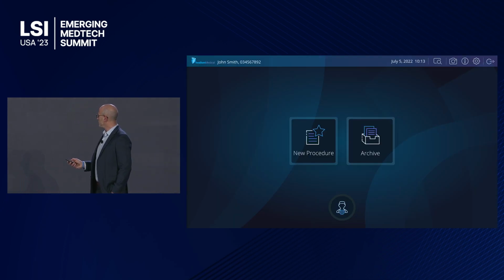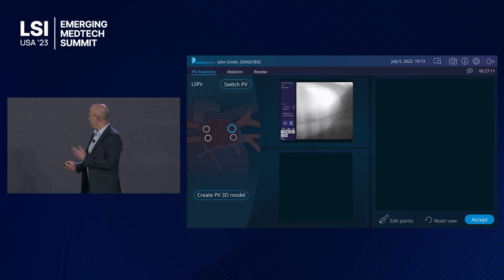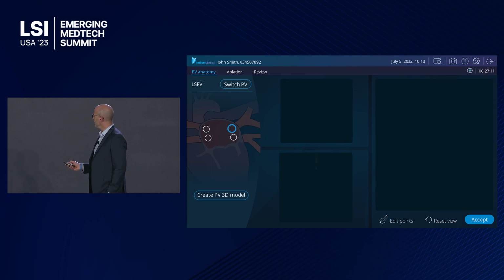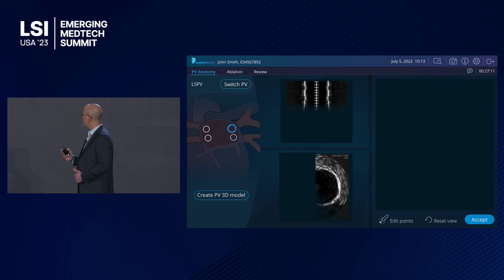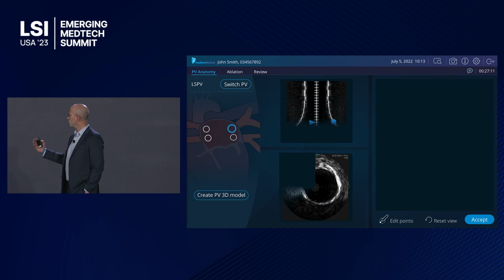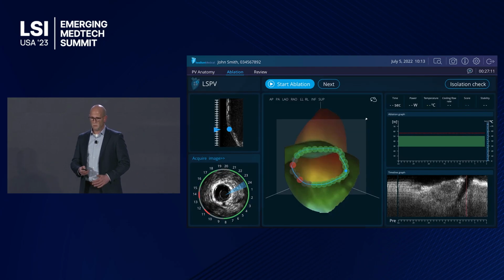So the way the procedure goes is that you insert a catheter over fluoroscopy, over the wire. You inflate the balloon when you get to the point that you would like. The motor unit pulls the transducer and starts rotating it to get the 2-dimensional images, the longitudinal and the cross-section. Based on that information, we can create a 3D model. Once we have that 3D model, we can rotate the transducer to create many ablation points, where at each point we monitor the changes in the tissue as we ablate to provide insight into the quality of the treatment.